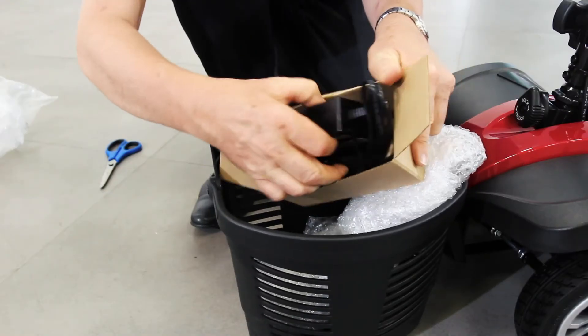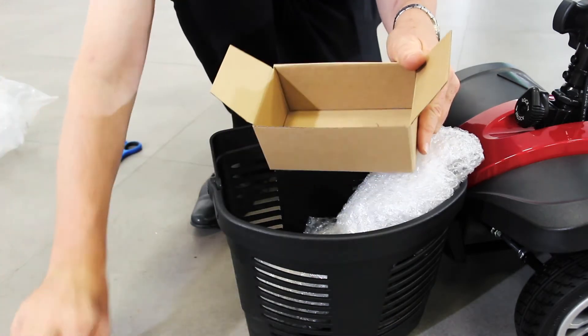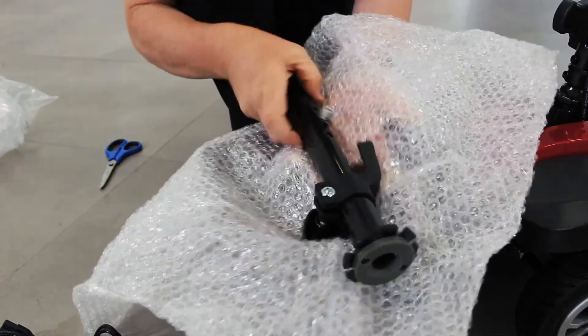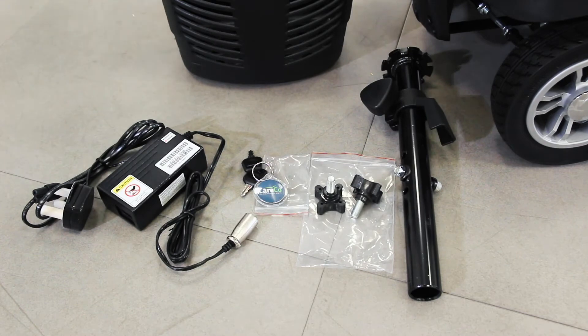Also in the basket is a charger to power your scooter battery. The battery can be charged both on board and off board. Finally in the basket you'll find the seat post as well as the ignition keys and a set of knobs for attaching the handlebars.